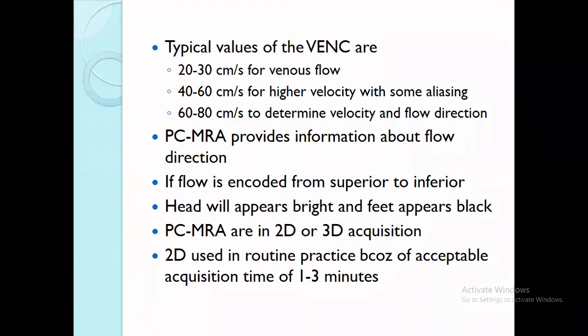So you can find the difference in the direction of the flow. For example, is it the direction of the arterial blood that is happening, or is it the venous blood? Because when we select this particular technique, if the flow is encoding from the superior to inferior, it means, for example, if I take an example of the neck area.